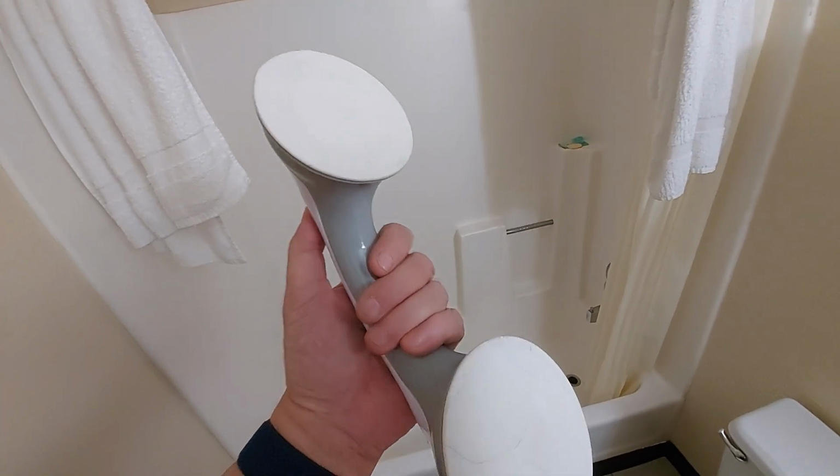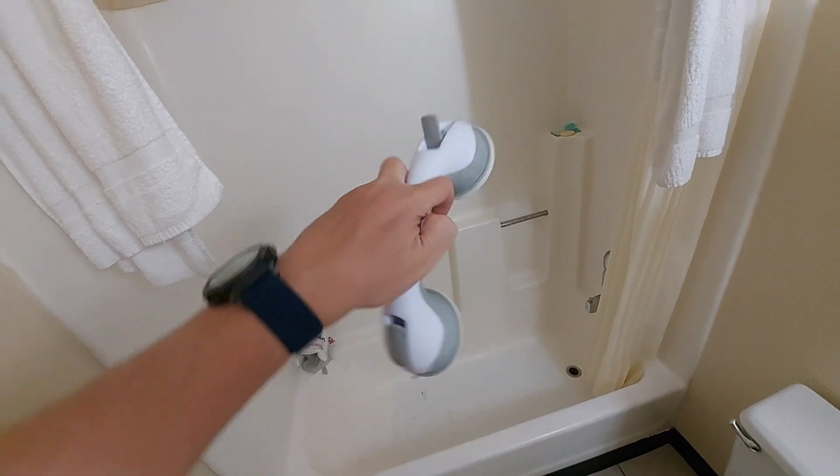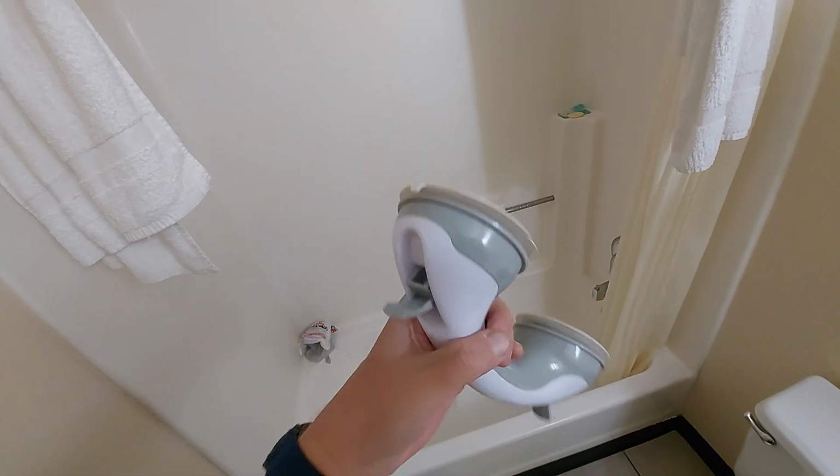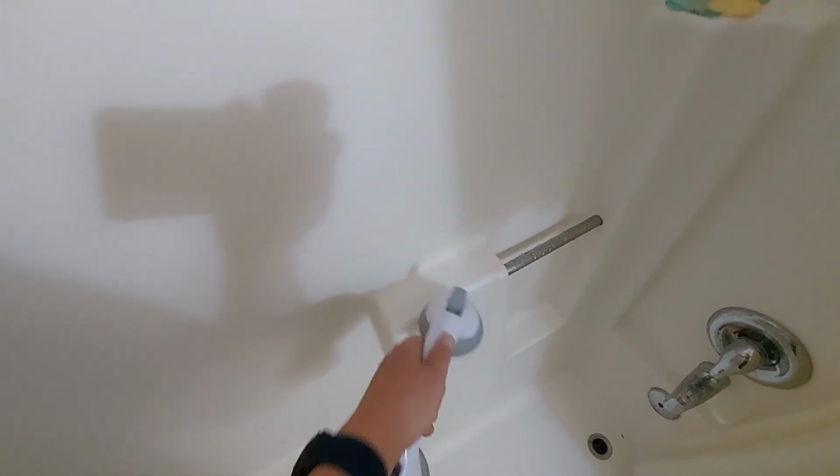Something I like to bring along when traveling are these handles, and they're real easy to use. You just lift up the two levers. They've got a rubber suction cup, and I'll just get those wet here on parts of the shower.